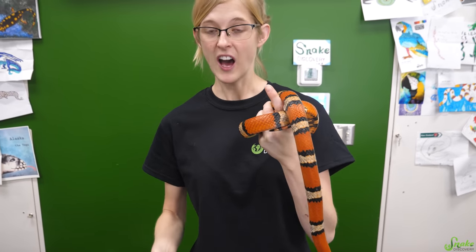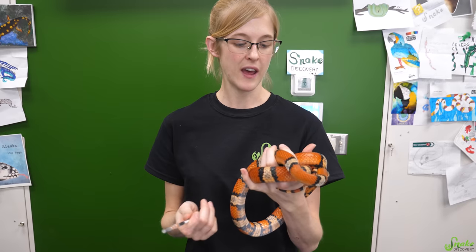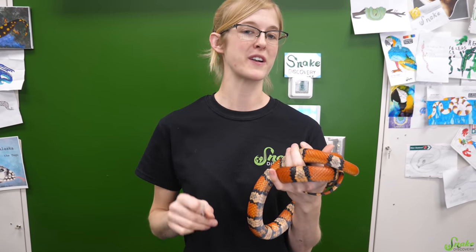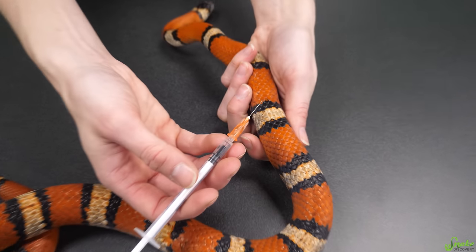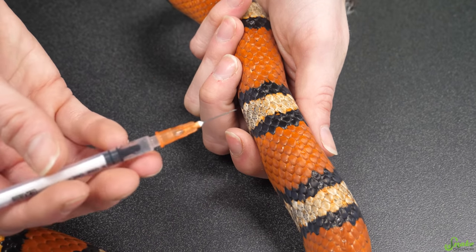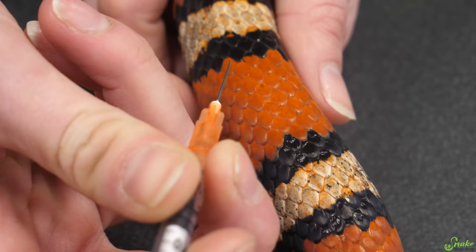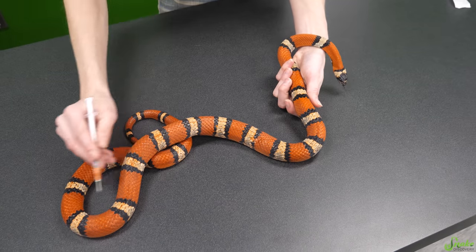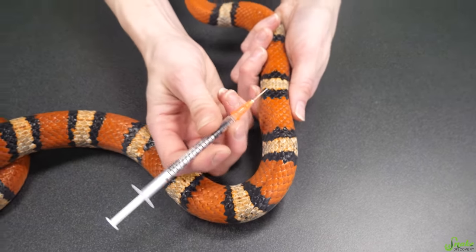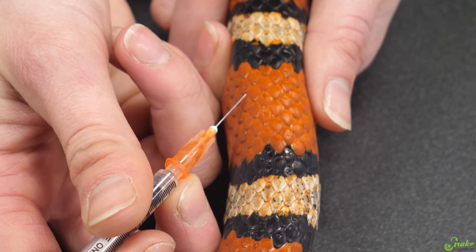A lot of the same information applies for snakes too, as far as drawing medications, making sure it's the right dose, and going in between the scales. But there's only one difference between giving an injection to a lizard versus a snake: you can't put an injection into a leg because they have none. So instead, the muscle you're going to use is the muscle just along the side of their spine, on either side. Make sure it goes into the first third of their body, so their heart can push the medication throughout the rest of their body.